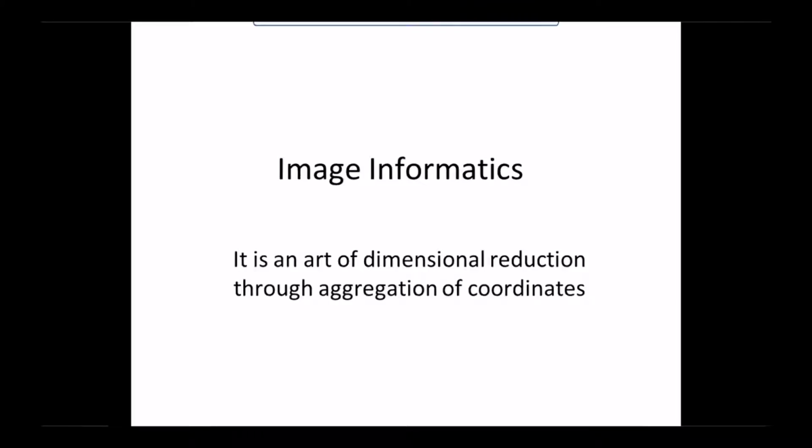So that's very high dimensional in that at every voxel location there is a number. So in a T1 image, it's the contrast under T1 density. In a DTI image, it's a vector associated with orientation, and for a vector of orientation at every voxel, there would be 3 numbers. That was the red, green, blue. And so those are dimensions. So if you add all that up, you're starting with something that's on the order of 10 million numbers.